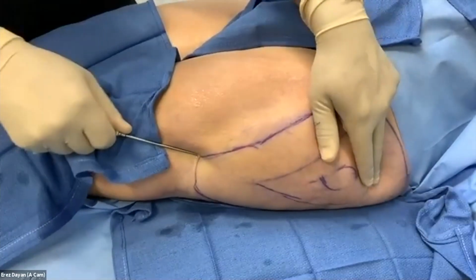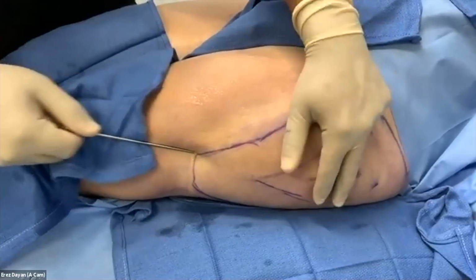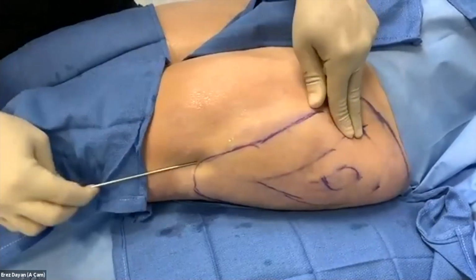You feeling that at all? Just pressure. Yeah, so usually patients do pretty well. I have it pretty well filled.